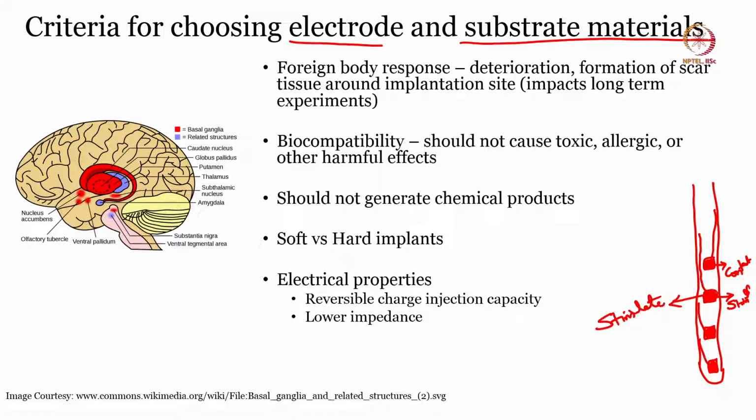The white region present between contact 1 and contact 2 is an insulator. The white space between contact 1 and contact 2 is just an insulator, so only the contacts will act as electrodes.